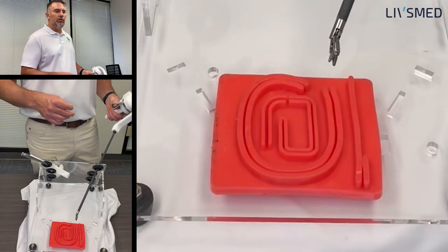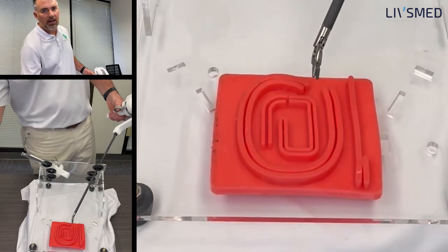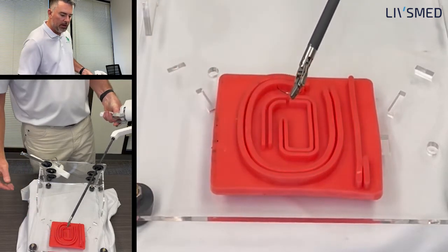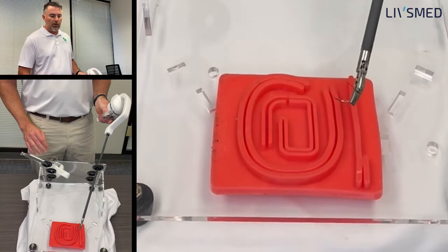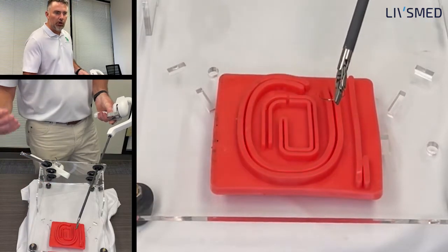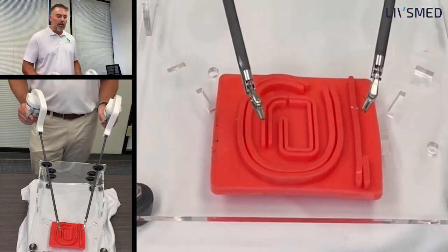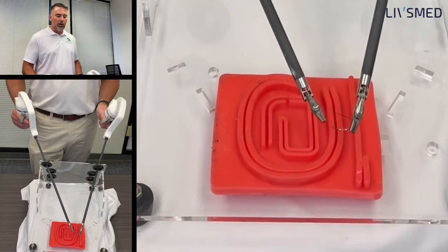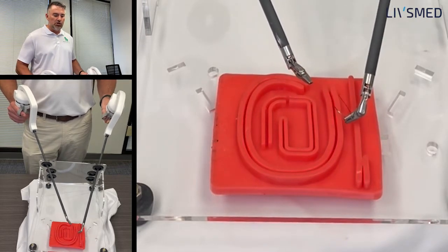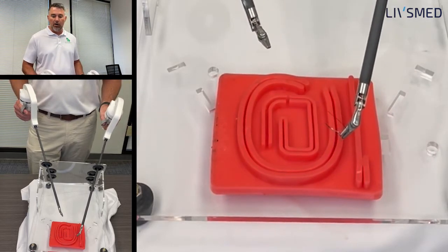Just like you would be sewing in an open procedure or straight stick laparoscopy, you're going to hold the needle the exact same way — grab the needle about two thirds up from the tip. Start the angle at which the needle comes off the needle driver from about 45 to 90 degrees. You don't want it facing in towards you because that can bunch you up. With wristed instruments, I can turn that needle out or back in towards me to guide according to where I'm going to be sewing, whether it's a bowel anastomosis or on the simulator.